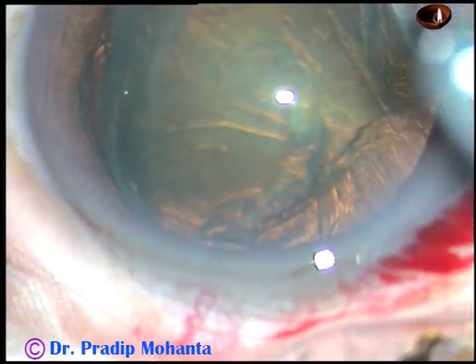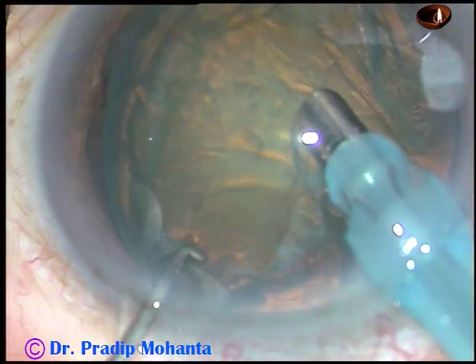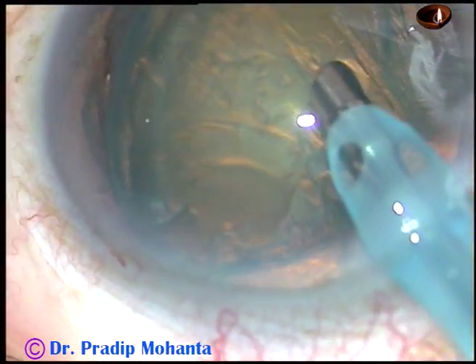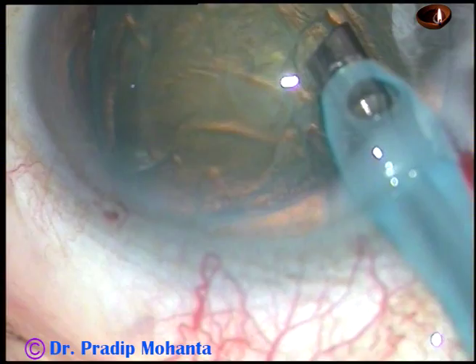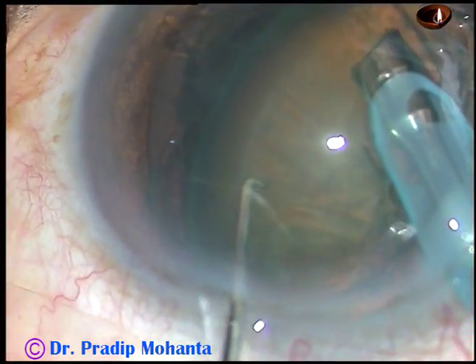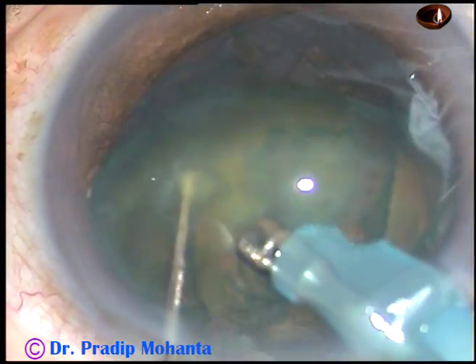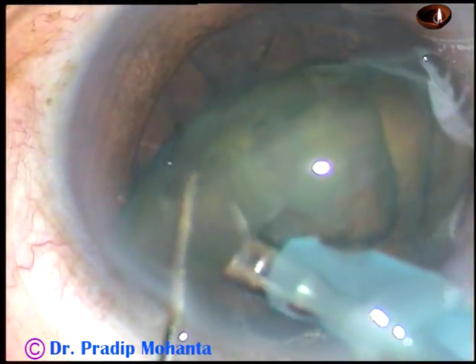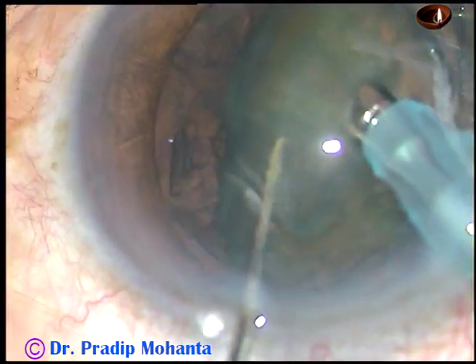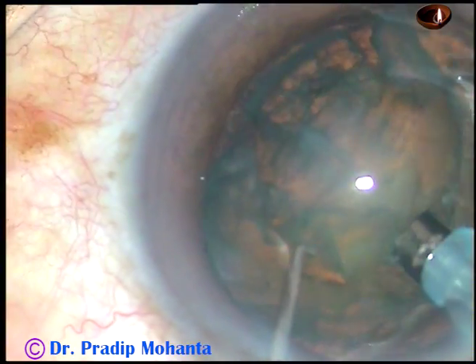The other equator is just above the anterior capsule, in the supracapsular area. A portion of the lens is being eaten up — the supracapsular portion has been emulsified.